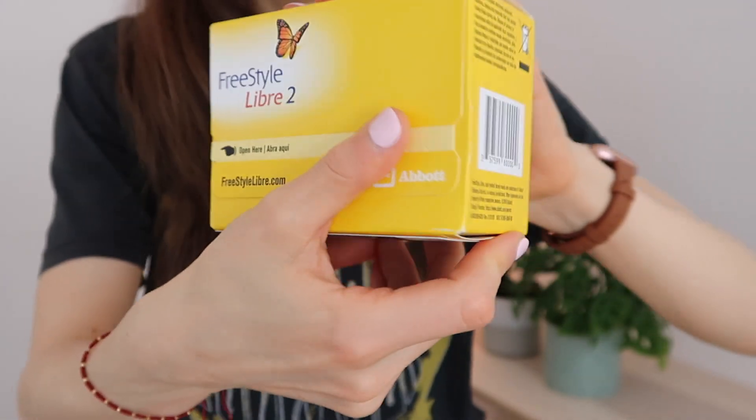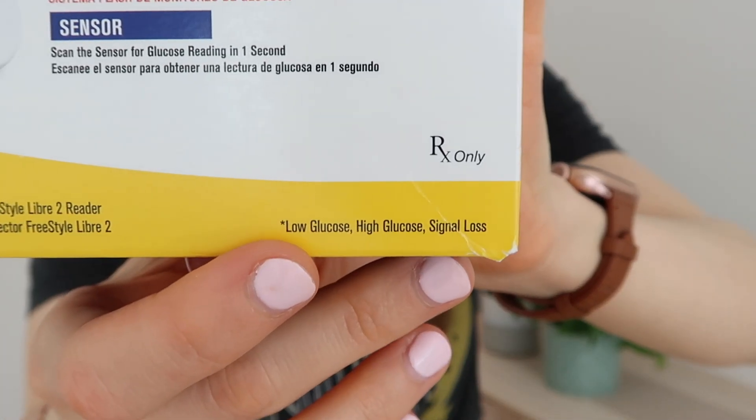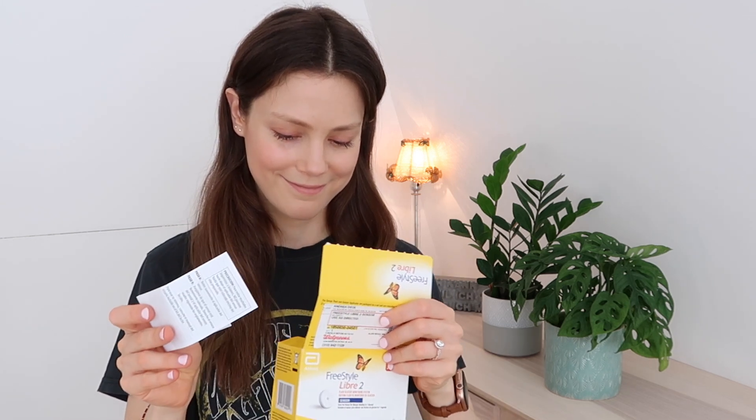Interesting to note: it says 'now with optional alarms,' and the asterisk at the bottom refers to low glucose, high glucose, and signal loss. So now we're getting to the nitty gritty of what is different about the Freestyle Libre 1 compared to the 2. This is a flash glucose monitor, which means you have to swipe to initiate getting readings. However, apparently with this one — and we're going to test it out — when you go high or low, it will push readings to you automatically without you having to initiate that swipe, allaying your fears overnight about going low and sleeping through it.